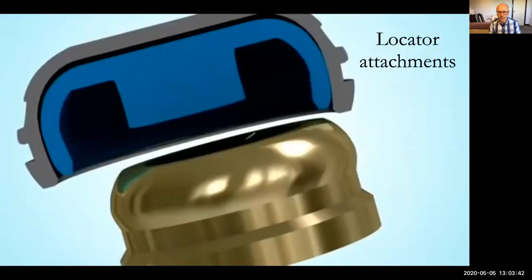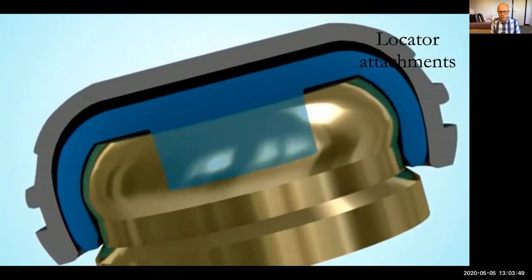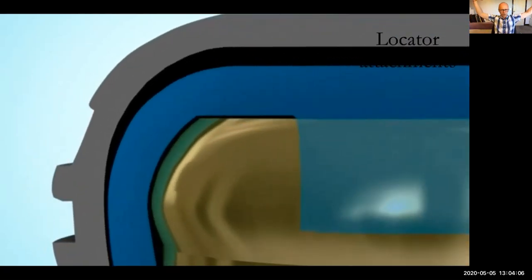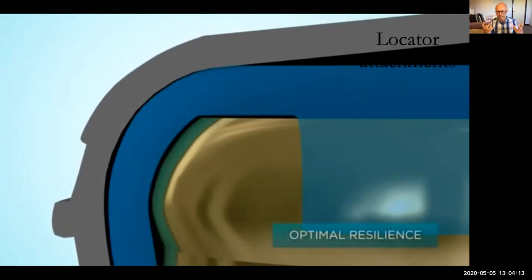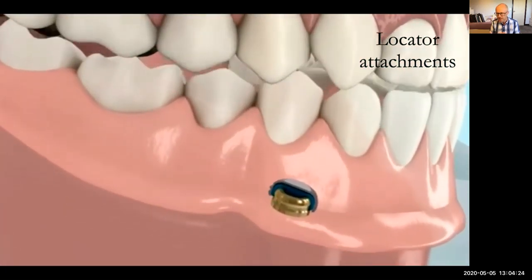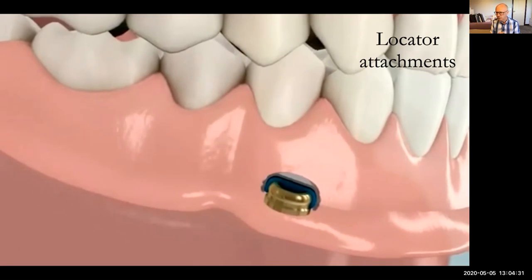Now, I've used Locators ever since they first came out back in around 2000, when I was working at Manchester at the dental school, and I really like them, for various reasons. Number one, they are small, so there's quite a lot of height above them for Rowan to put the teeth and metalwork and other stuff inside the denture, which gives him more space. But also, importantly, as we see in this video, it allows the dentures to pivot and be supported by the soft tissues. It allows that movement there. I really do think they're very good.